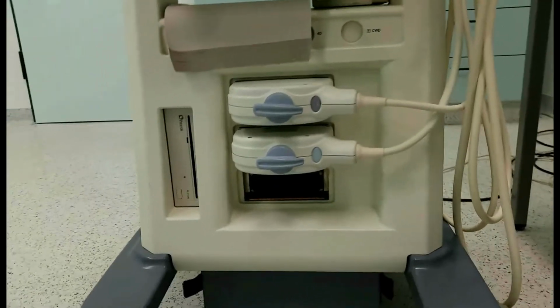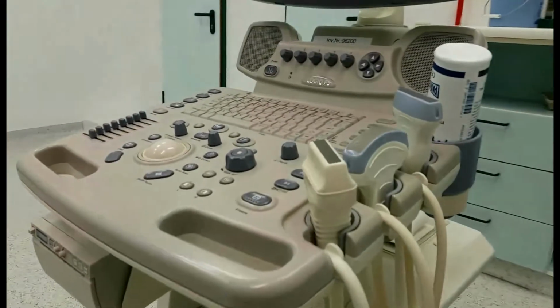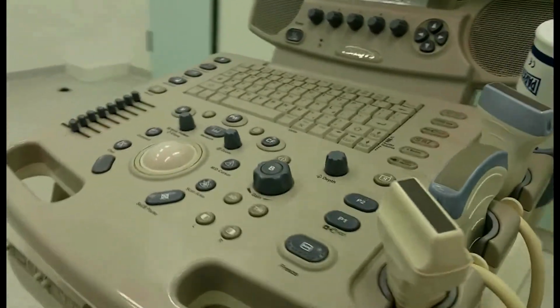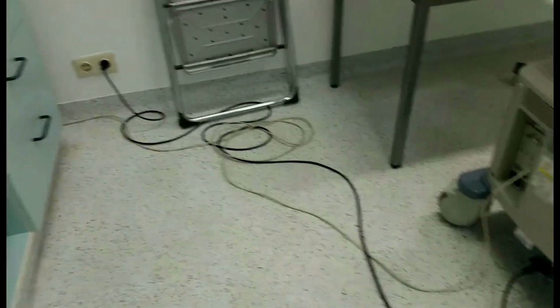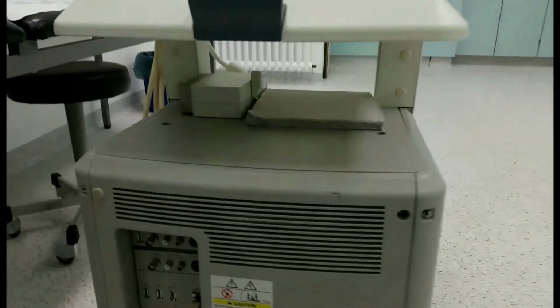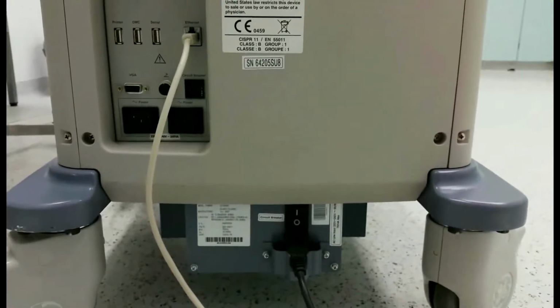Below we have plugs which belong to the ultrasound transducer, explained later. A common ultrasound unit consists basically of a monitor to see what we examine and a high performance computer unit. We also have a power cable with power supply and an Ethernet cable which can transfer data via network adapter to systems like HIS, that's the Hospital Information System, or also to the PACS, that's the abbreviation for Picture Archiving and Communication System.